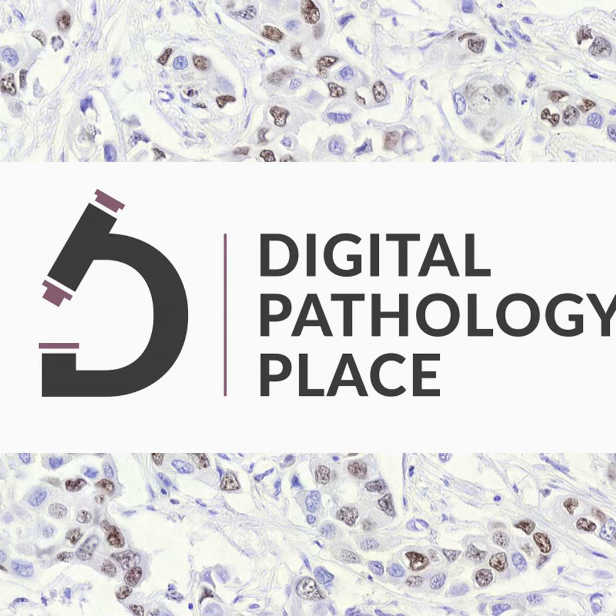So they assembled a data set of digital lung adenocarcinoma slides, 8,461 slides. That's a pretty big number, because they wanted to develop their computational EGFR biomarker. And I saw a case report two or three years ago about this, and I was waiting for the next thing. So what happened here is their fine-tuned open-source foundation model detected EGFR, and they conducted a prospective silent trial.